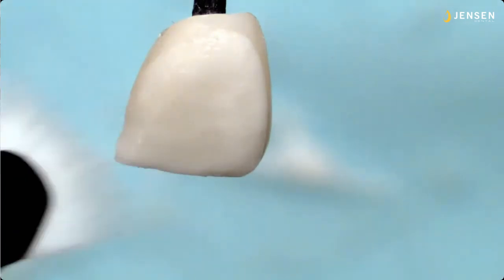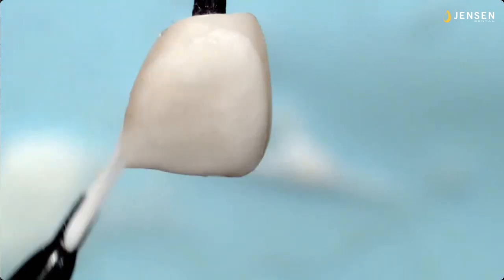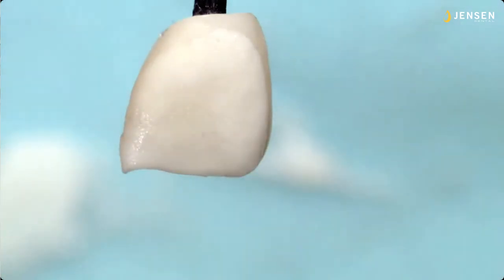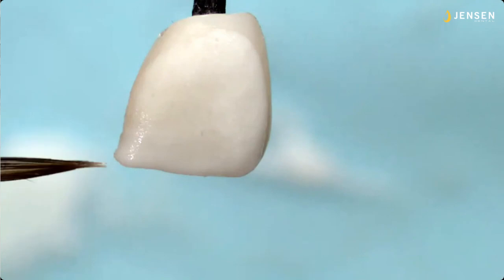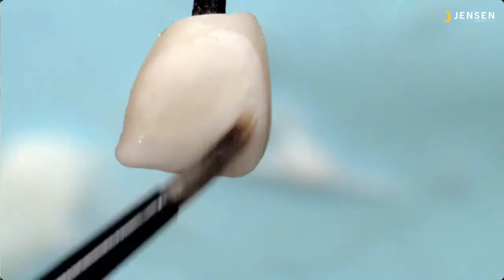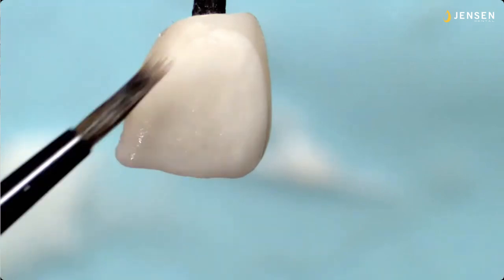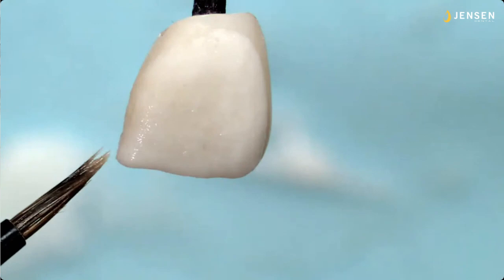Now that MiYO number 5 brush right there is a piece of equipment that loves to get dirt caught in those white bristles. And you can wipe it out with your fingers, you can wipe it on your shirt, you can wipe it on your pants, and it doesn't get it out. The only thing I found that really cleans that brush is a dry microfiber towel, a clean dry microfiber towel, not something you've had around the lab for a long time.